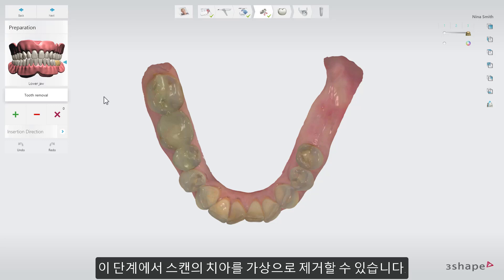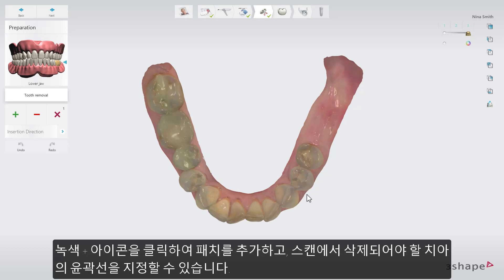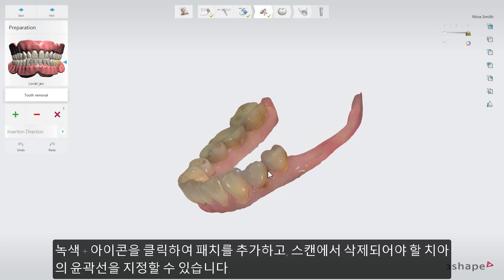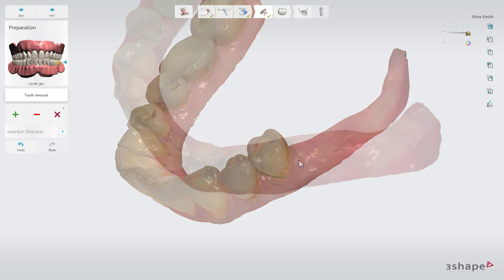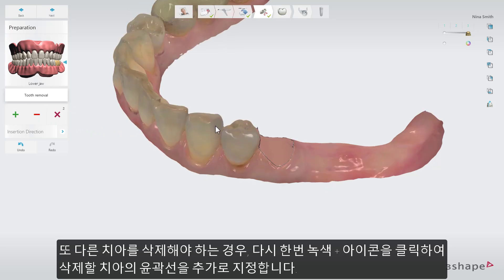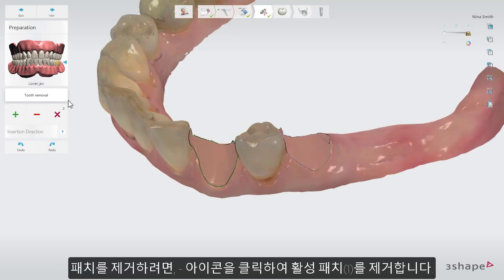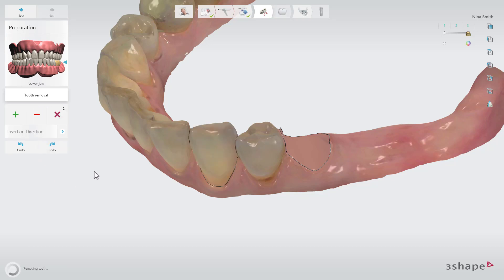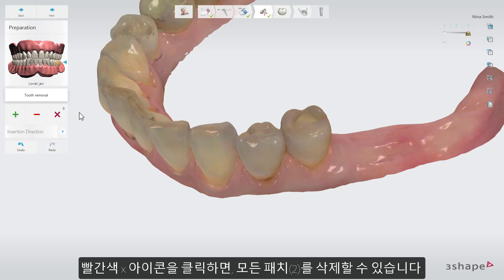From here, you can virtually remove teeth from the scan. Click on the green plus to add a patch and define the outline of the tooth which should be removed from the scan. If needed, click on the green plus again to define a new outline for another tooth you wish to remove. To remove a patch, click on the minus icon which will remove the active patch. You can remove all patches by clicking on the red cross symbol which will clear all patches.